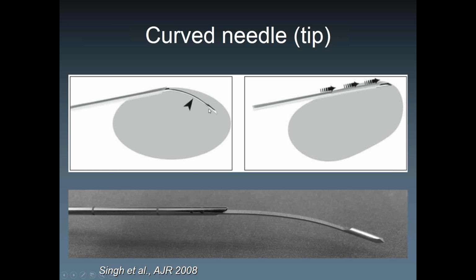The important thing is to bend it backwards. Don't bend it towards the trough, even though it's a little counterintuitive at first because you're thinking you're wasting tissue here. You're wasting some tissue maybe, but if you bend it the other way around, the moment the device fires, it's going to scrape off all the tissue here. You end up having no tissue at all. So it's important to bend the needle backwards, so to speak.